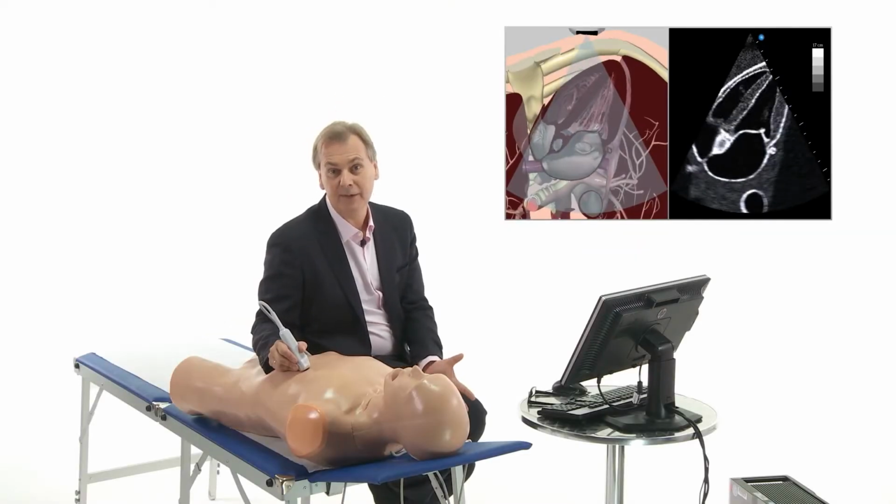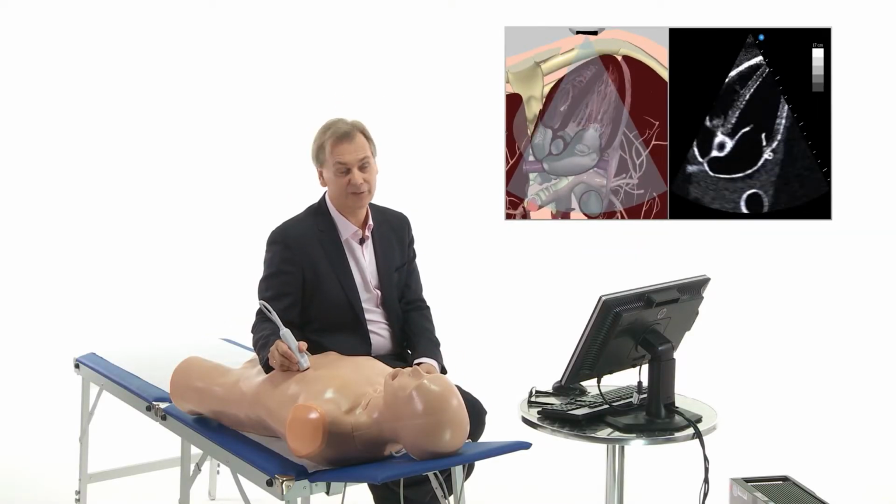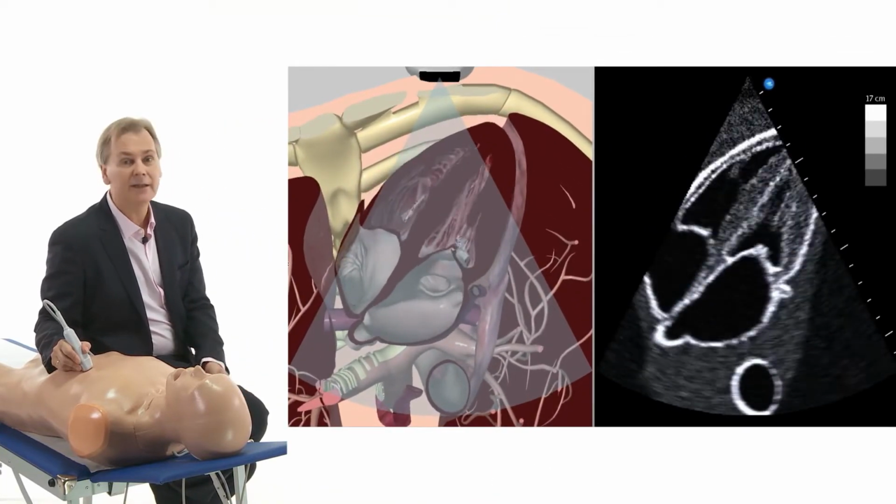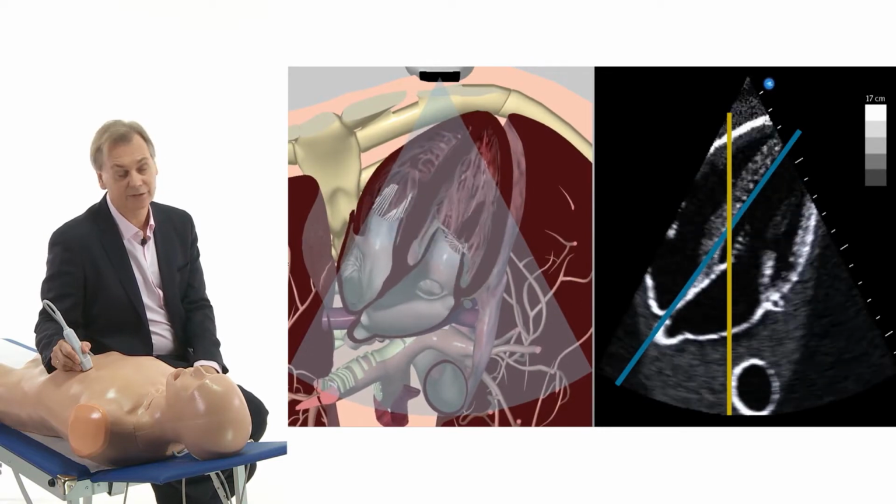Let me help you to optimize the image for a very good four-chamber view. Here we have, of course, all four chambers in the field of view, but the septum is not parallel to the ultrasound beam.